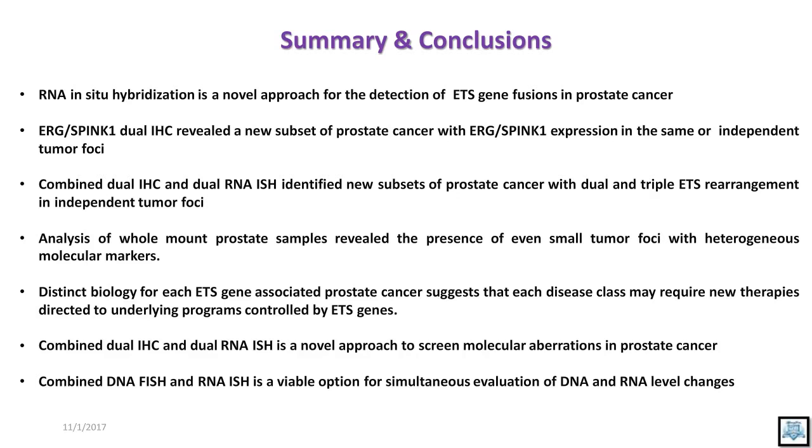Underlying programs controlled by the different molecules. The combined IHC and RNA-ISH is a novel approach to screen molecular subtypes of prostate cancer.